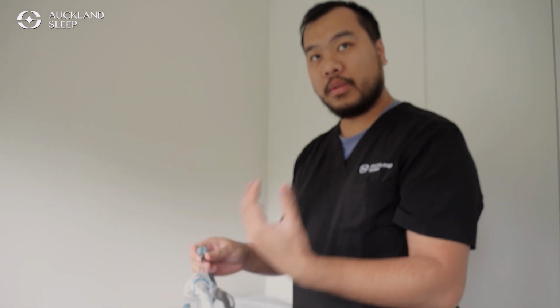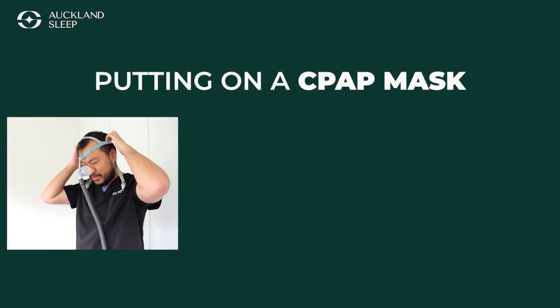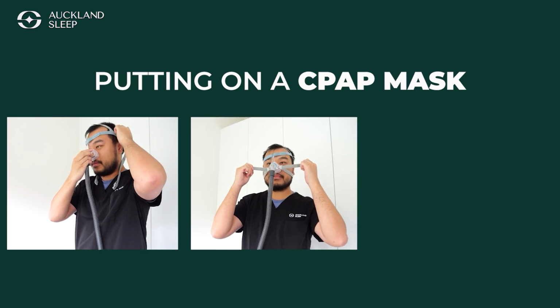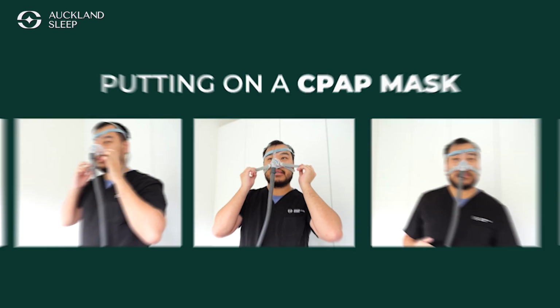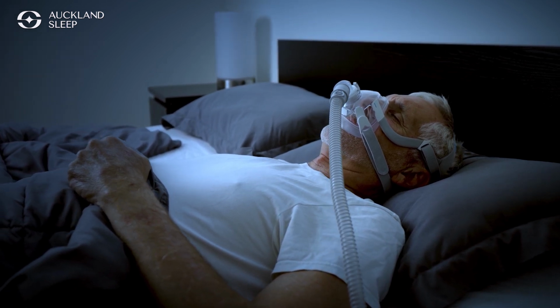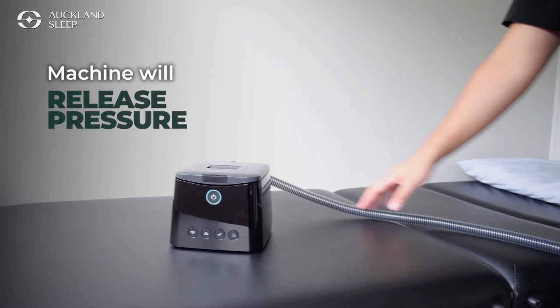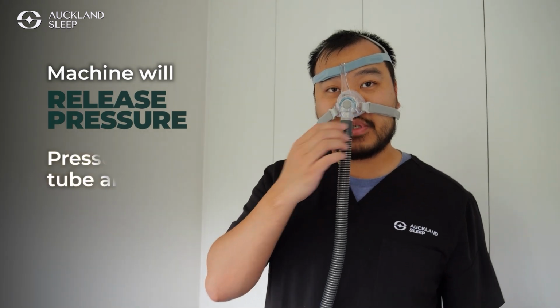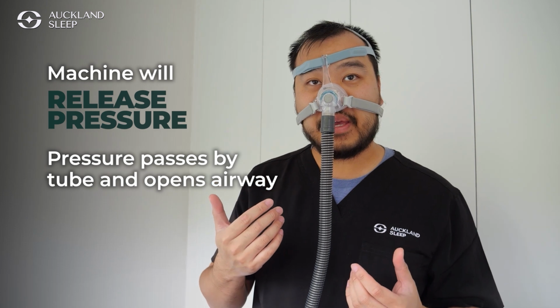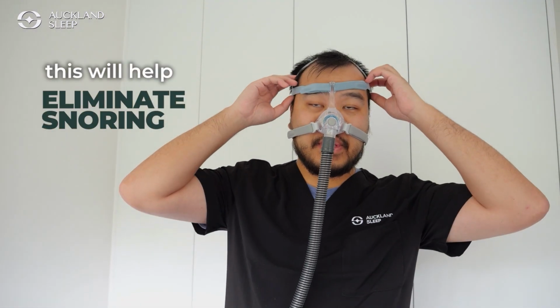Oh yeah, so this is a CPAP mask. This is what goes on the patient's face. With using CPAP, we're trying to stabilize and help the patient have more stable breathing when they are sleeping. The machine will output pressure and it gets delivered through this tube, so that pressure will help to split open the upper airway. Then they'll eliminate any sort of snoring, any sleep apnea, and hence eliminate any daytime symptoms.